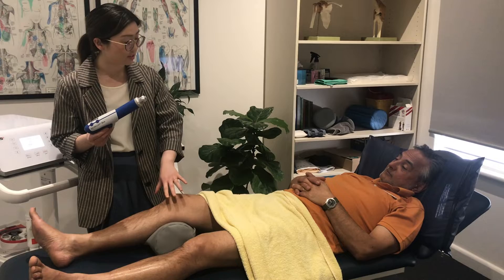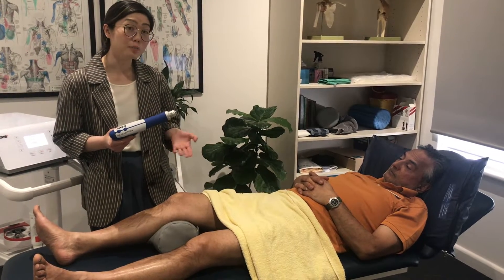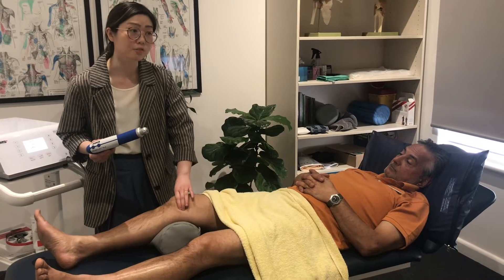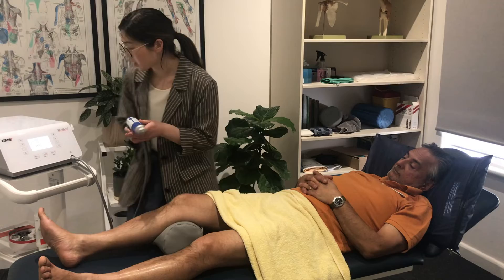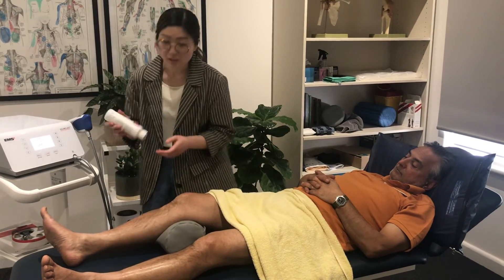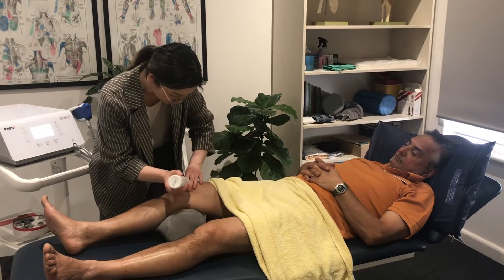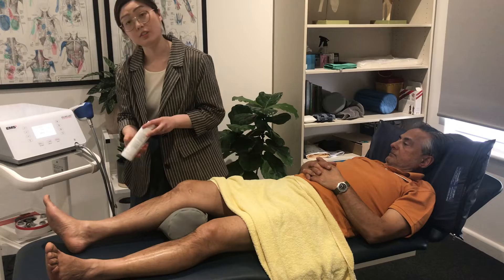Here's what we're going to do for an example on Russell's knee. In treatment, we take a test beforehand. We also feel through the joint to find the most sensitive area or region that we're wanting to target with the treatment. Once we've found that, we mark it down and apply some gel to the area. So with Russell, I'm just feeling along the joint line and applying some gel through there.